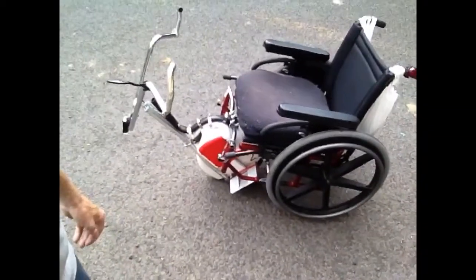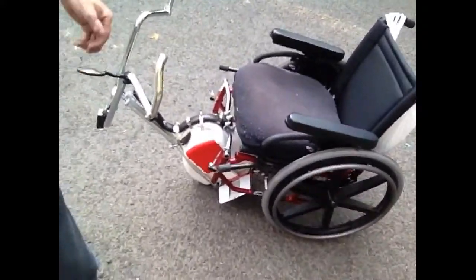Hello YouTubers and electric unicycle enthusiasts. My name is Bruce Wayne Hodges. What I've done here is — I own a unicycle and a wheelchair, as you can see. The unicycle is self-stabilizing.